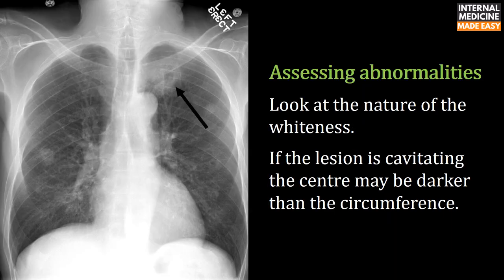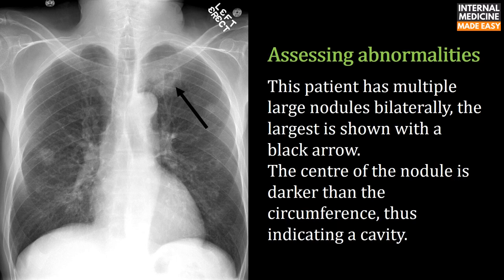Look at the nature of the whiteness. If the lesion is cavitating, the center may be darker than the circumference. This patient has multiple large nodules bilaterally; the largest is shown with a black arrow. The center of the nodule is darker than the circumference, thus indicating a cavity.